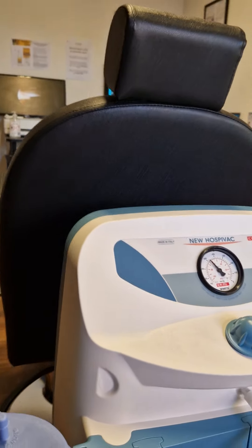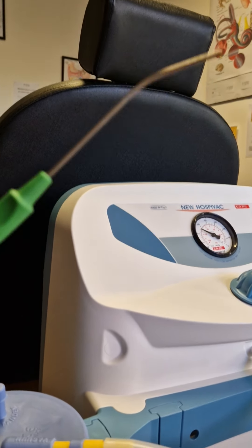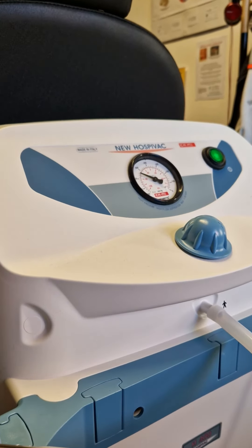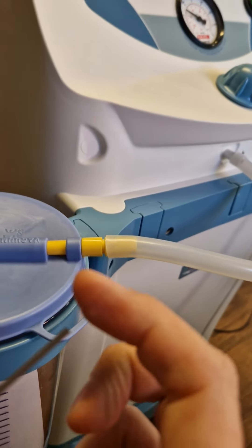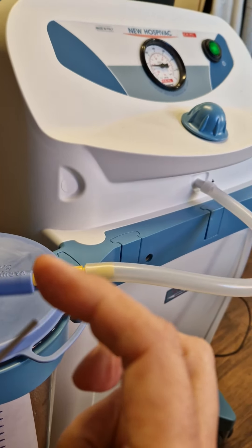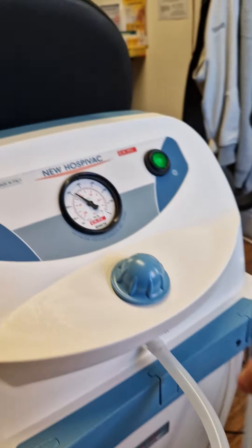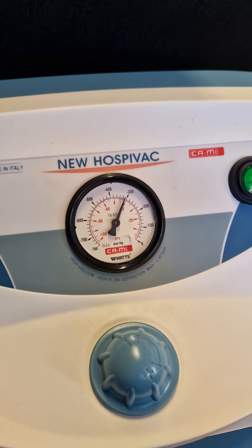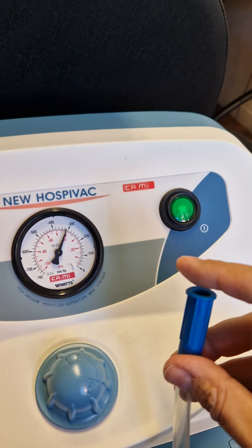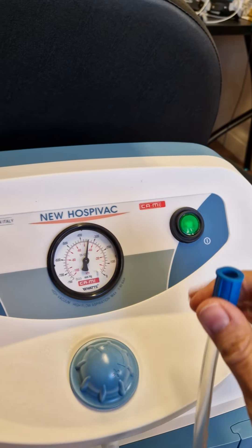This works by that button there, and it's attached to this suction tube. As you can see it's pretty small — I can just stick my finger on the end to give you some idea of the level of suction. It just gently pulls away. If I take this off you get a better idea of the power it can generate — when I put my finger on there, see it stays there. We're often waiting for a perfect seal and grip; when we get that you'll see the power goes up, and then we can start gently pulling the wax away.